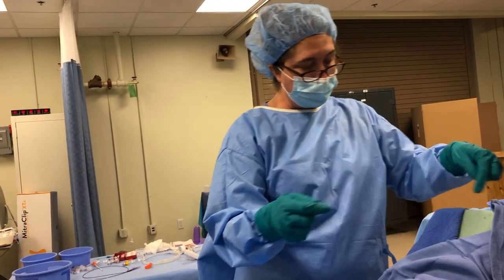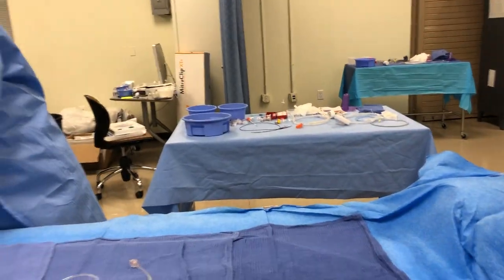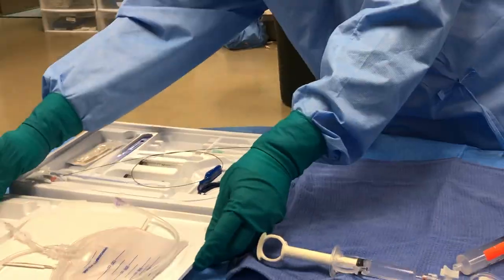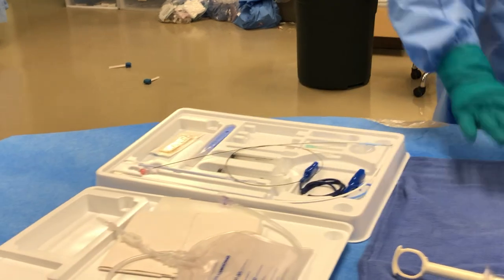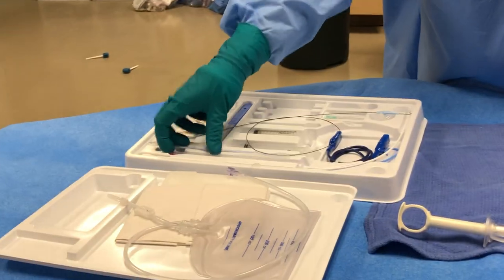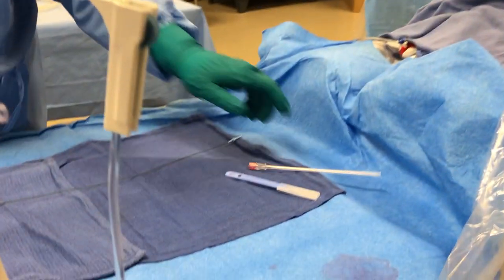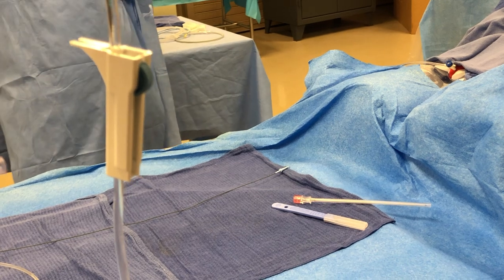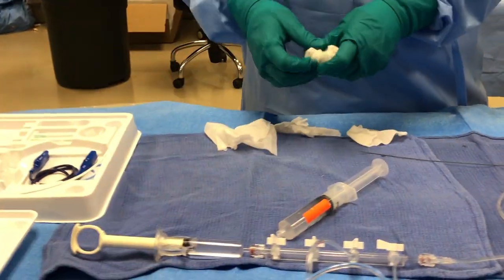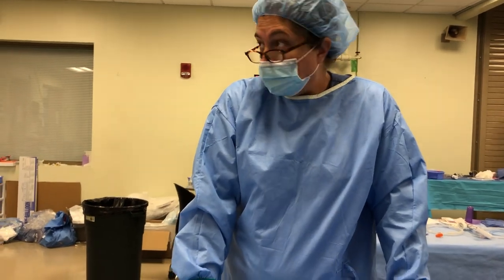I'm going to move this out of the way so I can see where I'm getting access. I'll go ahead and clamp off the bag and have it sitting there ready to go — it's one of the last things I'll need. First things I'm going to need are my needle, possibly my blade, and my wire. If we needed lidocaine, I would get that first, but this is going to be an emergent procedure.